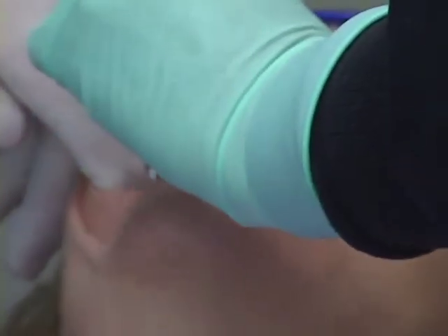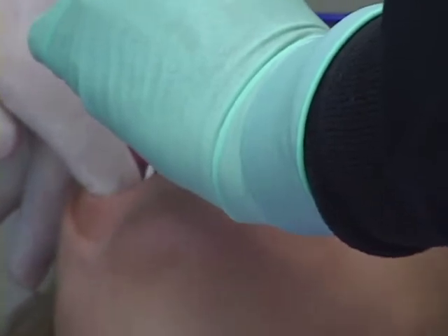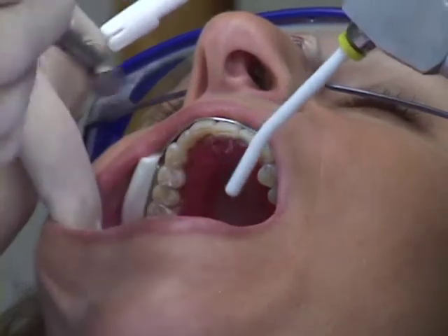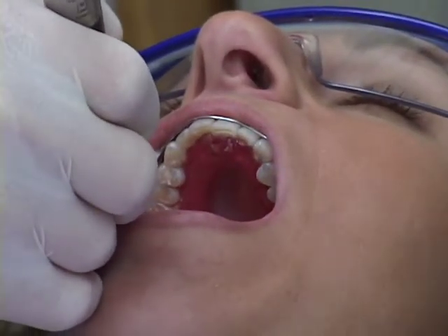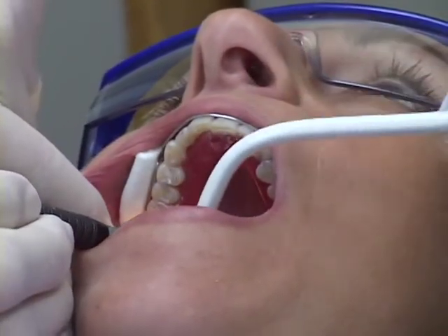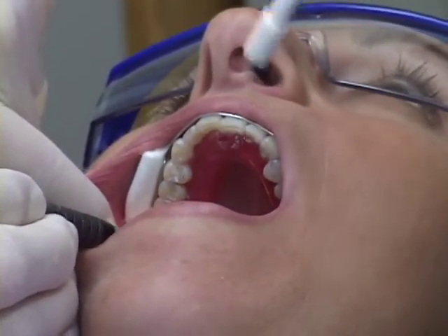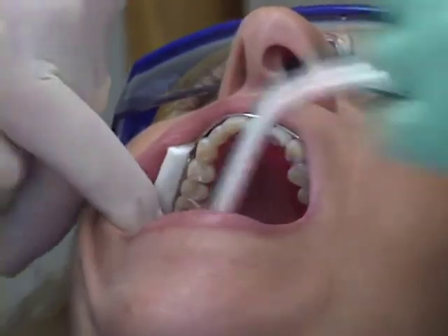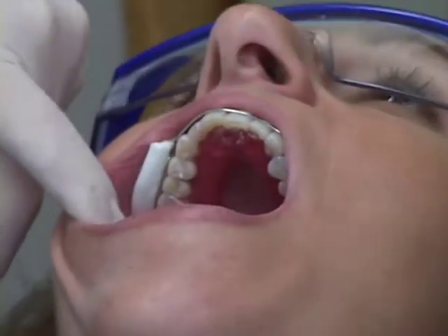Looking good there. Chop. You okay? Any sensitivity on that, Debbie? Good. Okay. And again, very typically there's going to be very little, if any, sensitivity. Usually none at all. And on the issue of sensitivity, interestingly, I can tell you I've done probably between 600 and 700 equilibrations. I have never, to my knowledge, created a sensitive tooth.